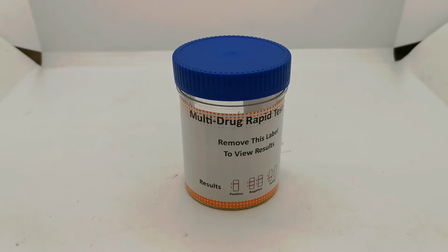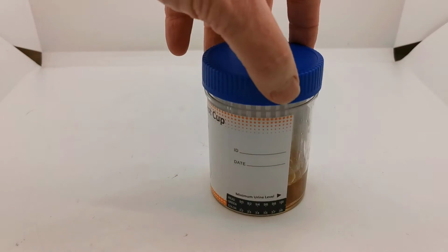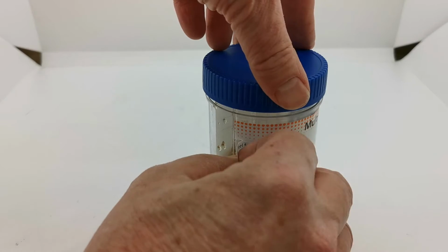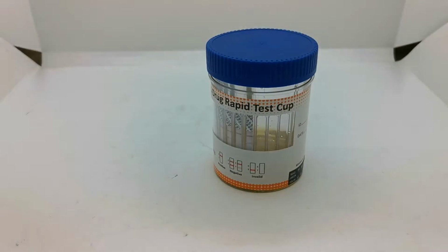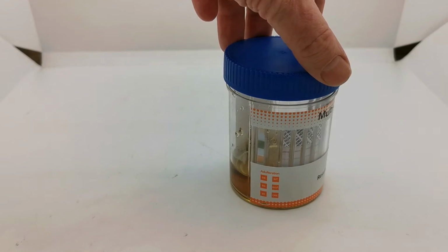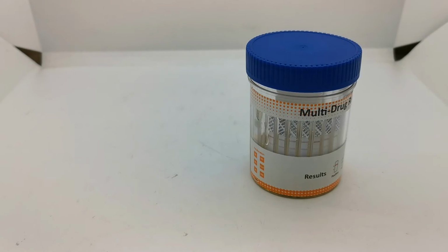This cup has now had a simulated urine sample added to it. If I just rotate it round, you'll see the sample in the base, and clearly it exceeds the minimum fill level for this test. Now, as soon as the urine sample has been added to this test, it will start running. So it's important to bear that in mind for your read times of the test results. I'm going to remove this panel, which is the label panel to view the results, and you'll see already all of these test membranes have started running and most of them are already showing control lines and test lines. So it is possible to read this result quite early if you have got an all negative test.